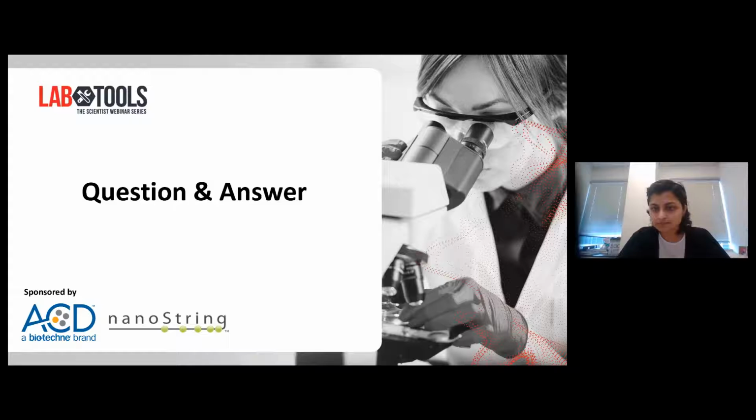Thank you very much. Next question for Kit. What is the maximum number of colors that can be run simultaneously? Alternatively, what's the maximum number of masks or segmentations that can be introduced simultaneously? That's a good question. So when selecting your regions of interest, the physical instrument itself has 4 fluorescent color channels.